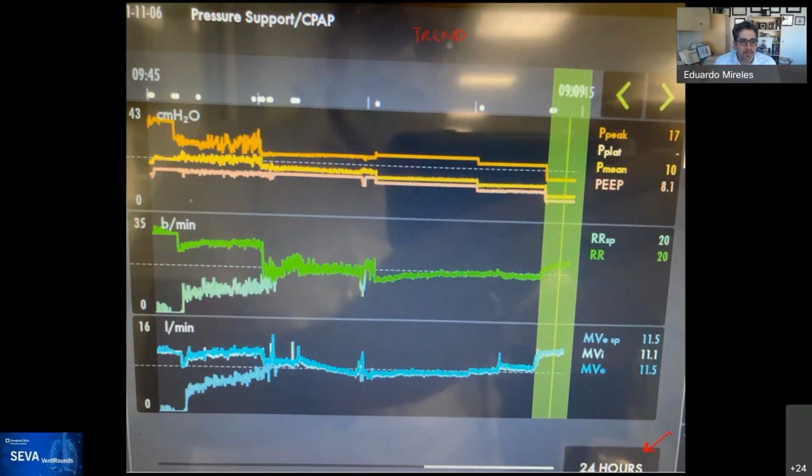So in this patient in particular, at this period of time over here, the patient was on volume control. And we woke the patient up. We stopped the sedation, and the patient started having those waveforms that you saw at that period of time. So during this period we dropped the rate, and we changed the patient from volume control to auto mode, PRVC to volume support.